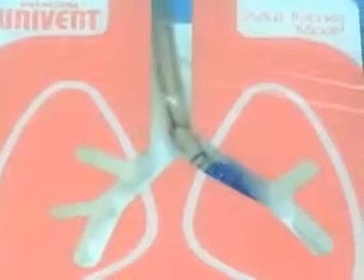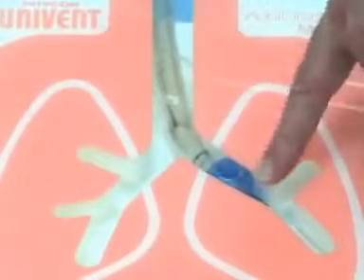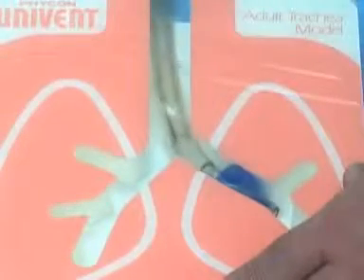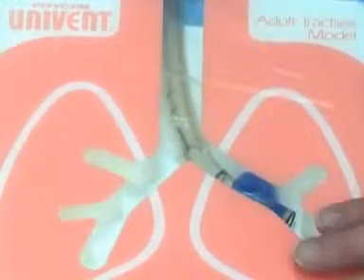If you inflate the tracheal and bronchial cuffs and now when you look you see the carina but no blue at all — the blue is a little bit too far down — the danger is that if you go too far, you're not going to inflate the left upper lobe. Pretty soon you'll be in trouble because you're only ventilating a small portion of one lung.